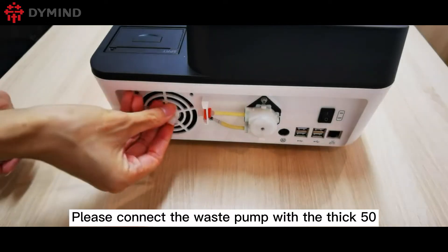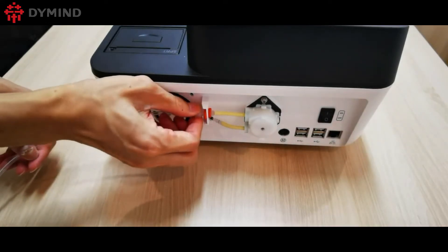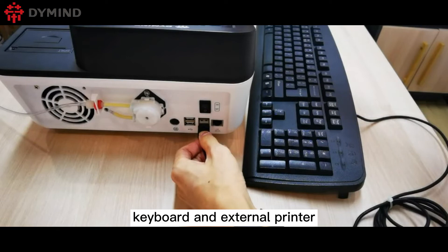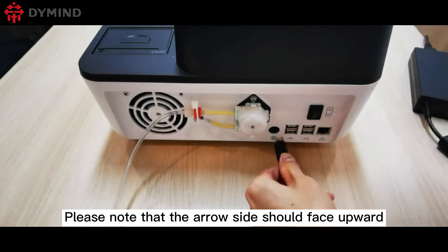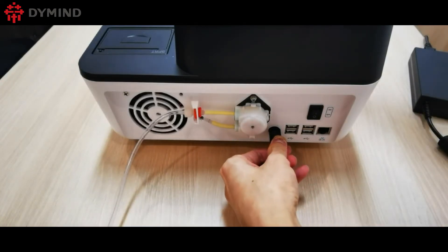Please connect the waste pump with the thick 50 tube and screw it tight. The USB ports can connect the mouse, keyboard, and external printer. Please note that the arrow side should face upward, then connect the power cable.